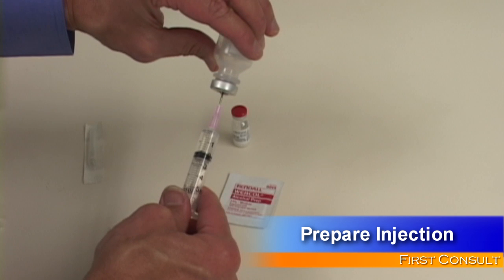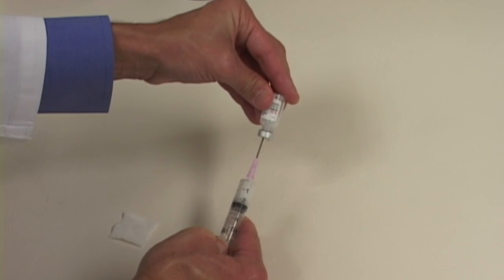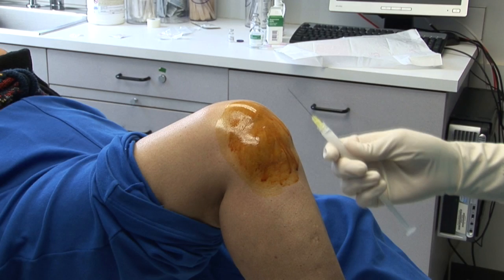Draw up 2.5 cc's of Marcaine and 40 mg of methylprednisolone acetate or the equivalent into a single syringe using an 18-gauge needle and mix well by tipping the syringe backwards and forwards. Remove the needle and place a sterile 27-gauge needle on the syringe.